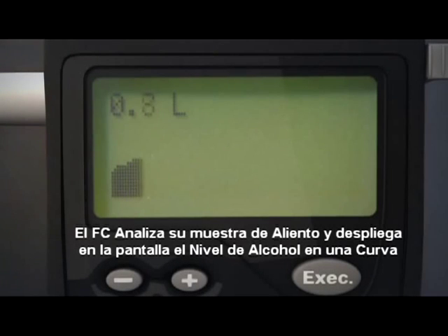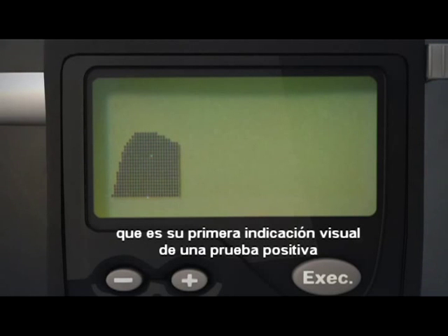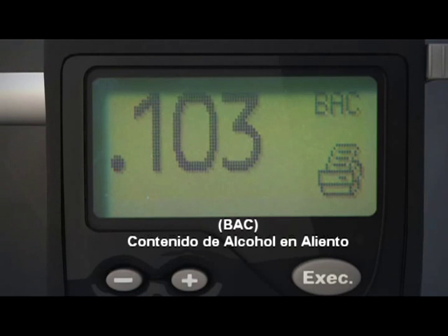The FC analyzes your breath sample and displays an alcohol curve, which is your first visual indication of a positive test. This is followed immediately by a precise three-digit breath alcohol content measurement.